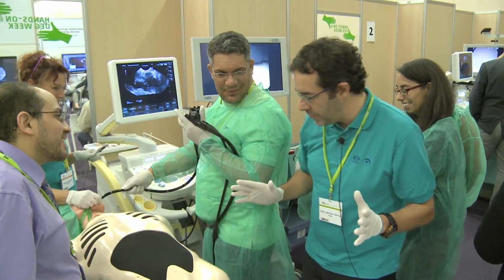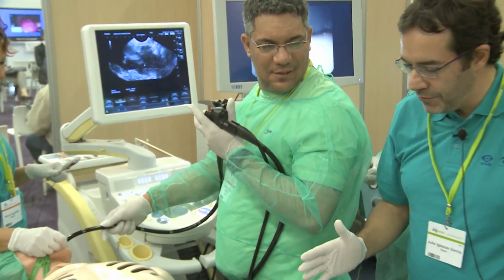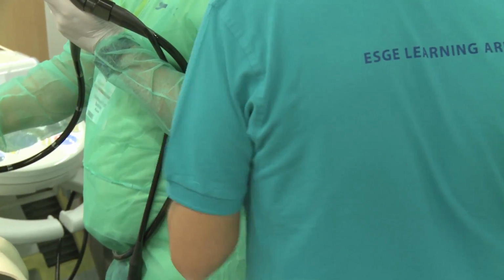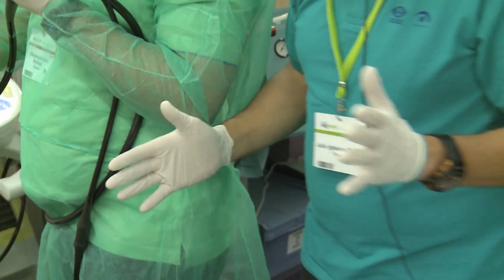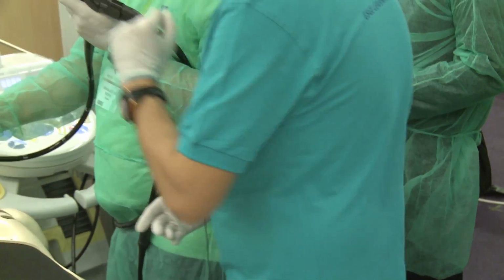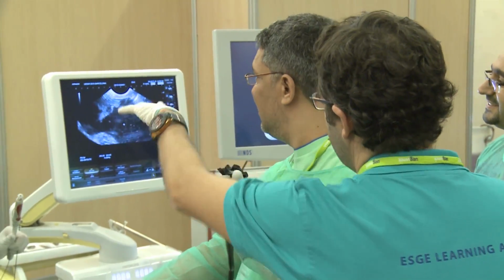So you need to go like this and like this. If you do this tango movement, I'm from Spain, so we're closely related with Argentina, okay? If you make the tango move, it's very easy because you're going to have a much more stable position and you're going to find everything easier. You see it. You got it.